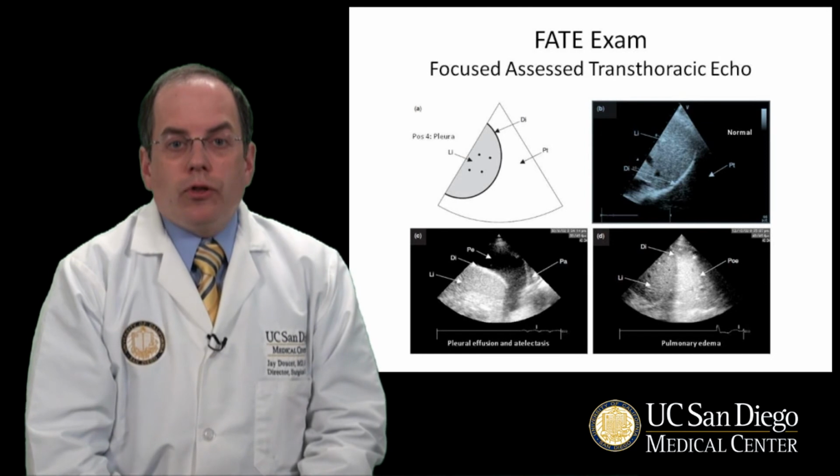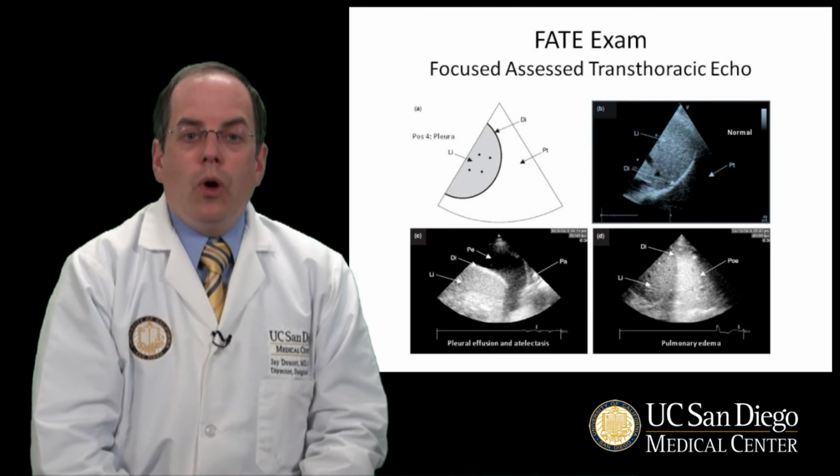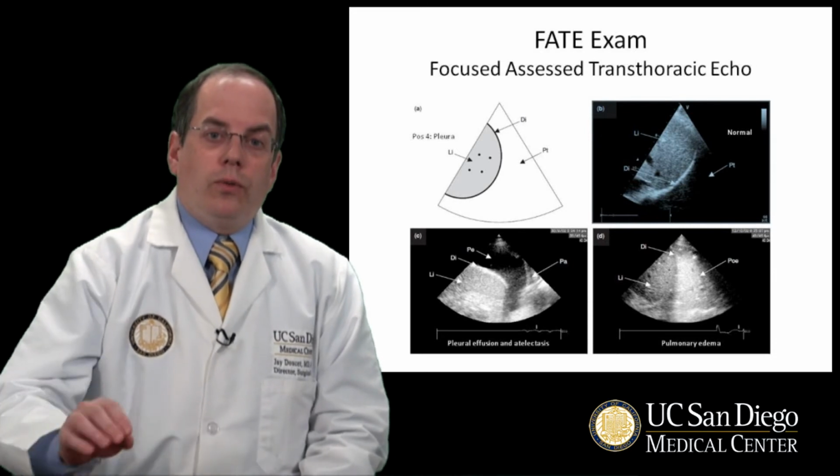In addition, it's also possible, in the same method as described previously, to pick up the presence of pleural fluid or pneumothorax in association with this examination.